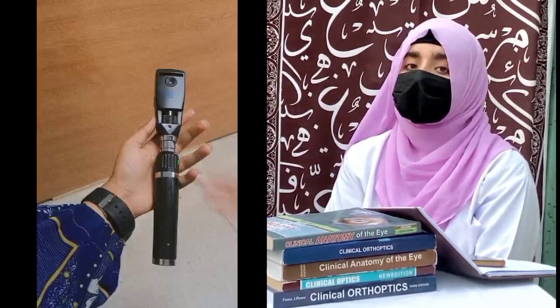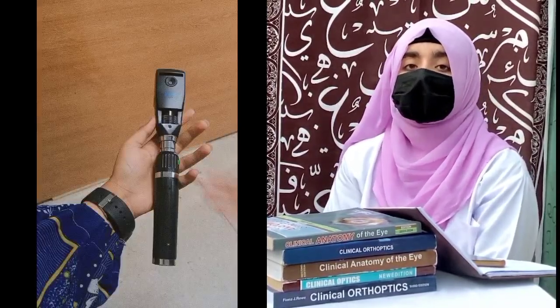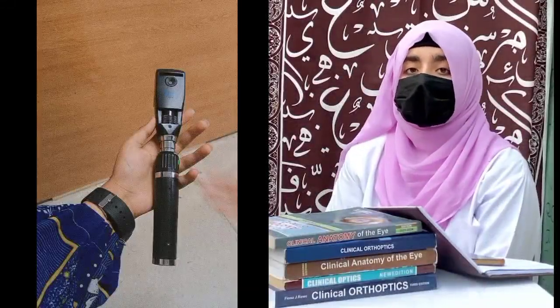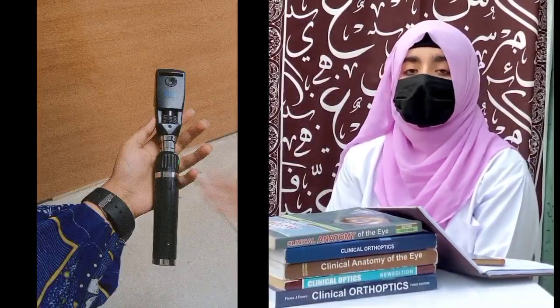First of all, I have to introduce what retinoscopy is. Retinoscopy is a technique used to obtain an objective measurement of the refractive status of an eye by using an instrument called a retinoscope. There are two types of retinoscopy: static retinoscopy, in which accommodation is relaxed, and dynamic retinoscopy, in which accommodation is active and the target is at near distance.